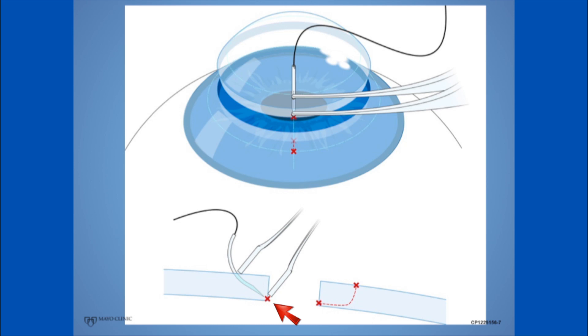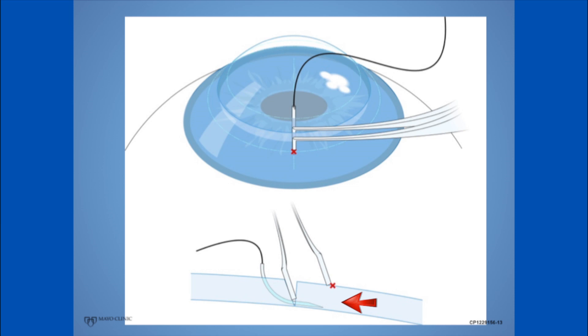In the second act, we need to engage the cornea on the opposite margin in such a way that the suture is radial and also deep and parallel to the posterior surface of the cornea.